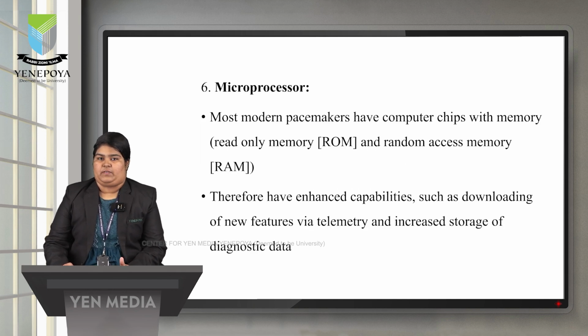Next is the microprocessor. The microprocessor has RAM and ROM. It has the memory capacity to store all the data collected from the patient, and this can be used as diagnostic data for further interpretation and for further management of the disease.